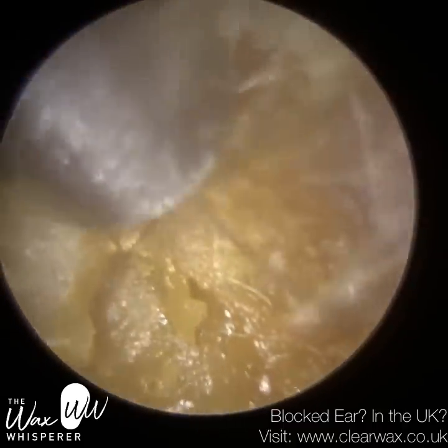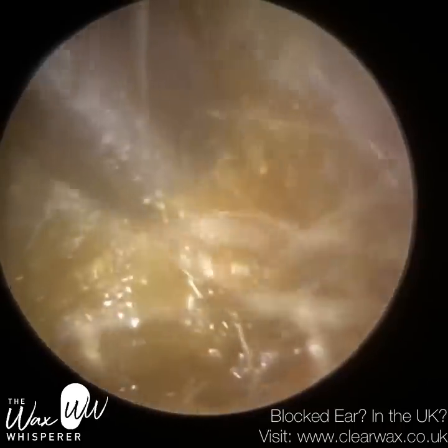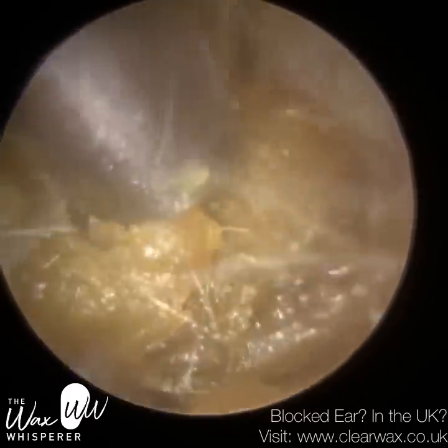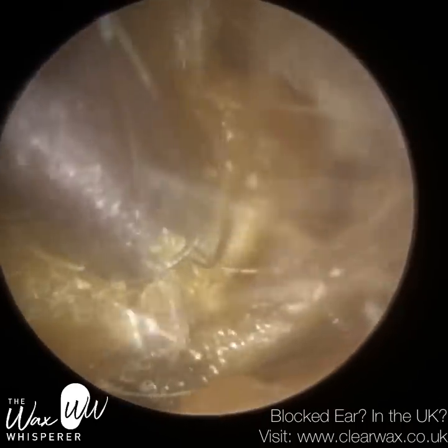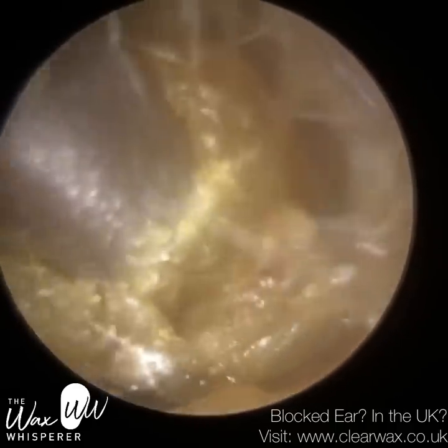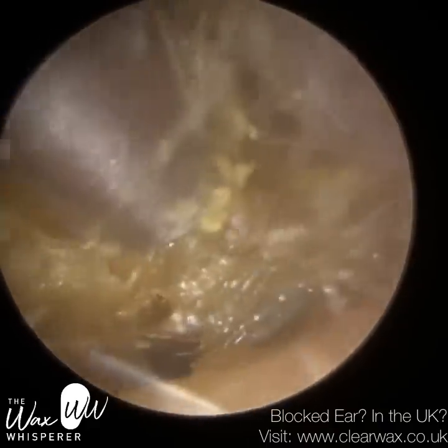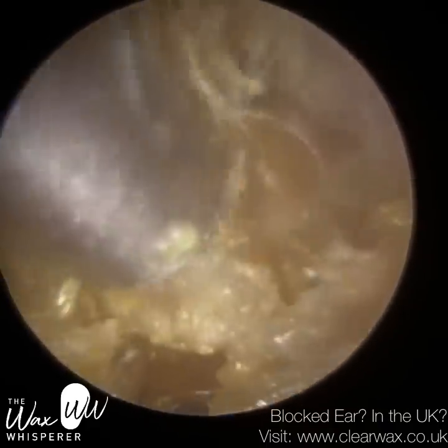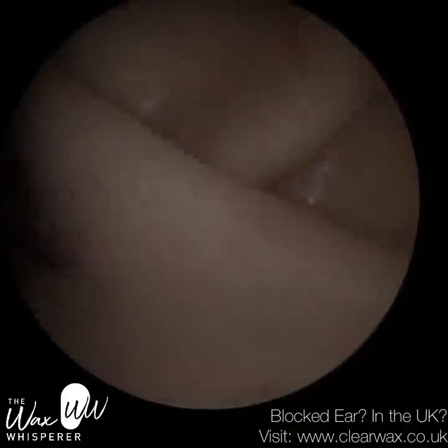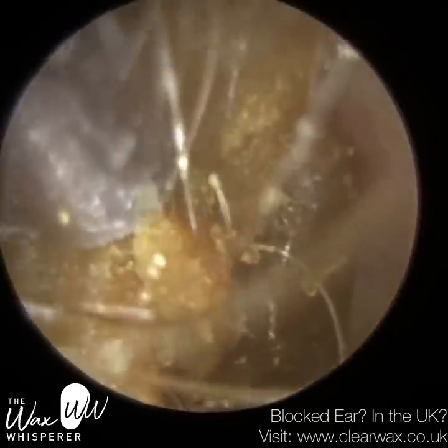This is their left ear. As soon as I removed the blockage from the right, they suddenly noticed their left ear was also blocked — up to that point they felt it was completely normal, because in comparison to the right it was substantially better. Earwax buildup is a benign condition; it's slow growing and it creeps up on you. It's similar to presbyacusis — age-related hearing loss — where it can take patients almost 10 years to realise they have some degree of hearing loss.